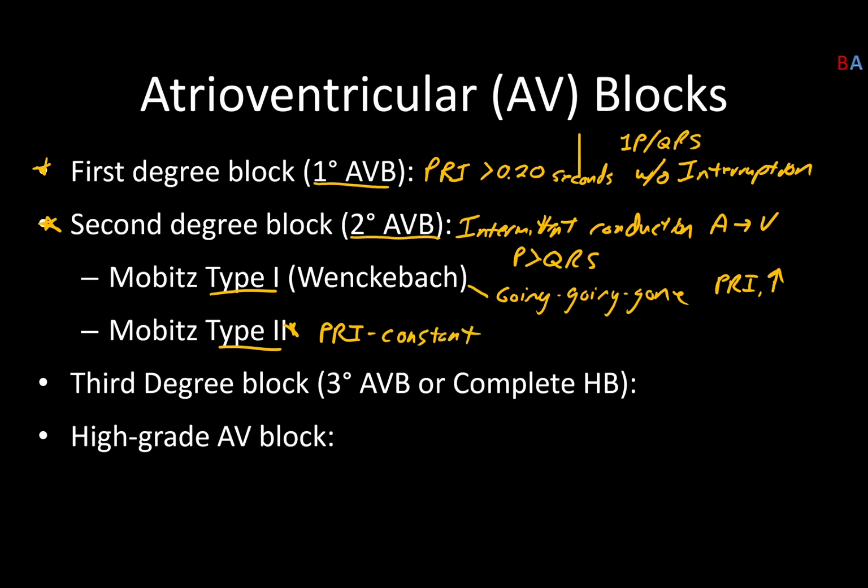And that really is the only difference between type 1 and type 2. Type 2, the PRI is always the same. Type 1, the PRI increases, it gets longer.